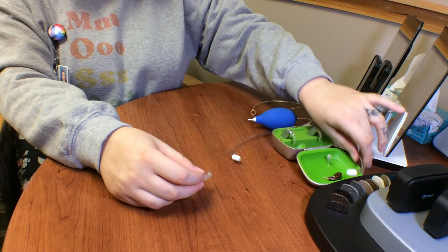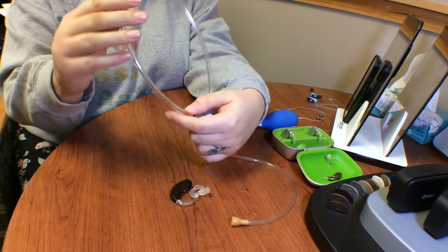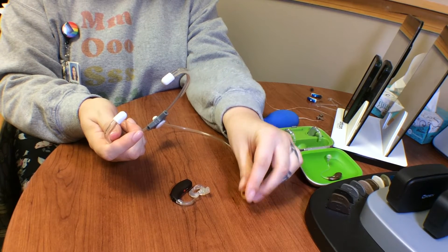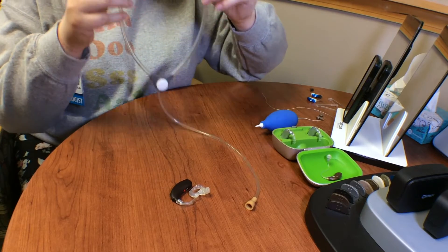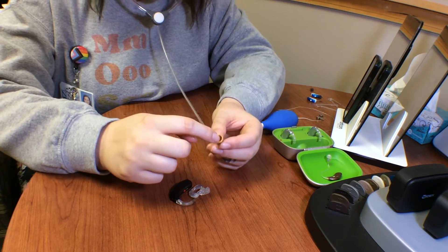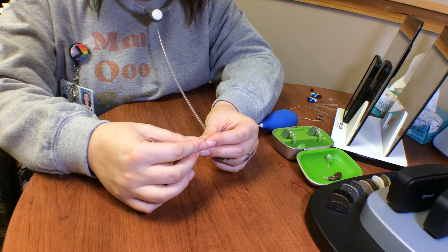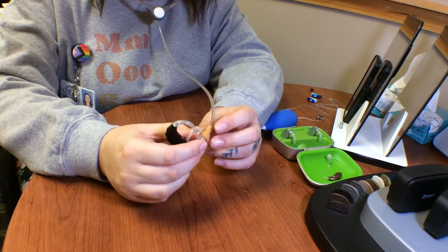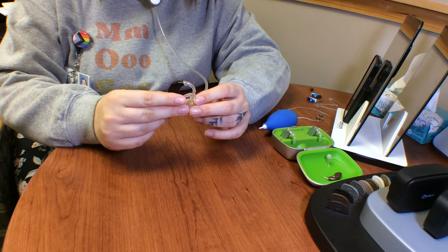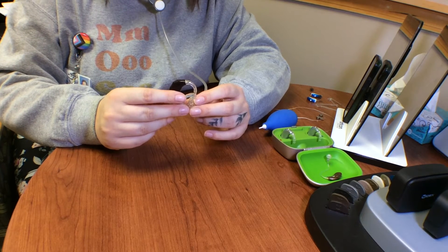The very first thing that you want to have handy is a listener. This is just one example of what they can look like. Generally what you'll have is a piece that goes down inside your ears, and a piece that connects to the hearing aid itself, so that you can hear the output of the hearing aid. You'll put the listening end into your ears, and then take the end of it and put the ear mold down with a nice seal into the base of your listening tube. You'll want to use some common sounds — I like to use either the Ling-Six sounds or generally vowels and consonant sounds — so that I can get a good sweep of what the hearing aid output is doing with different sounds.